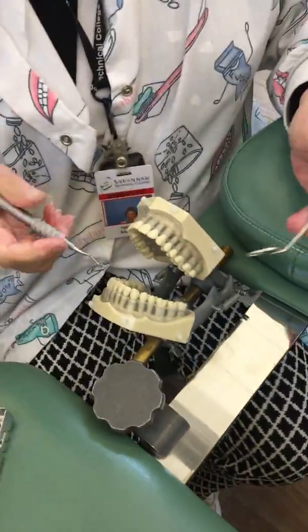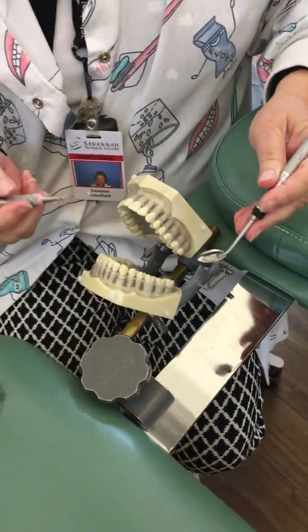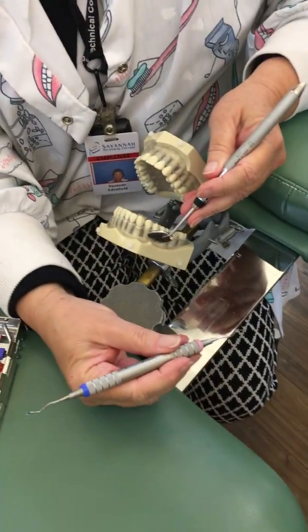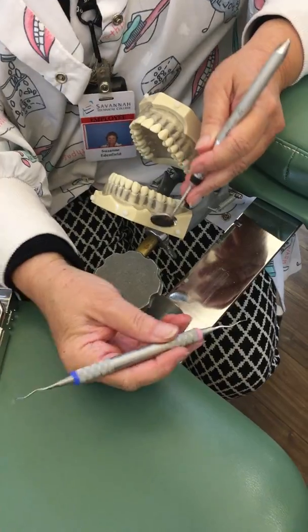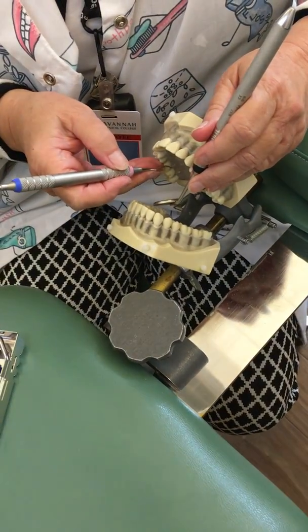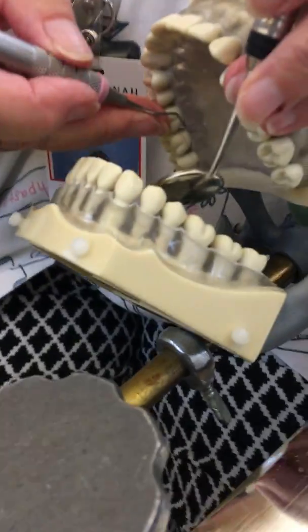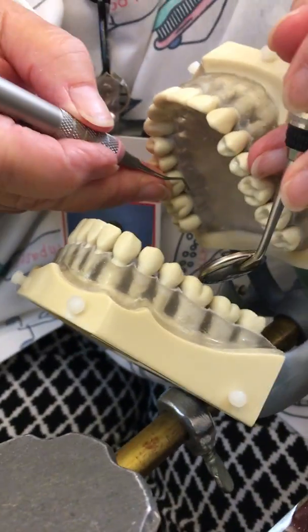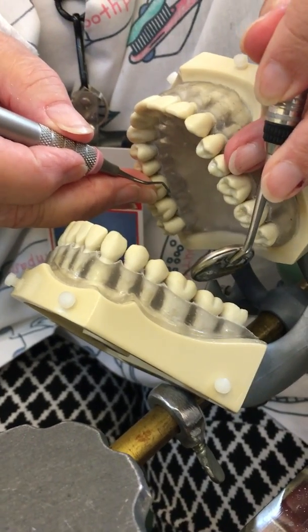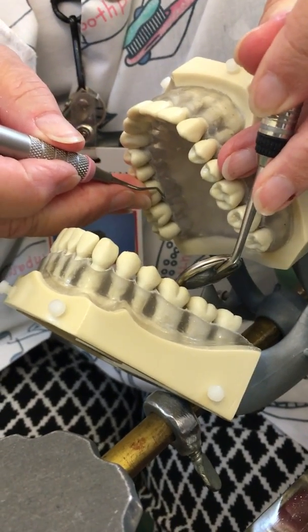Now we're going to move to areas three and four on the maxilla and start with our 13/14 Gracie. I'm going to place my fulcrum and, because it's a distal instrument, I'll check it on the distal for the correct end. This time we are going to look at the lower third of the shank — it should be parallel to the long axis of the tooth.